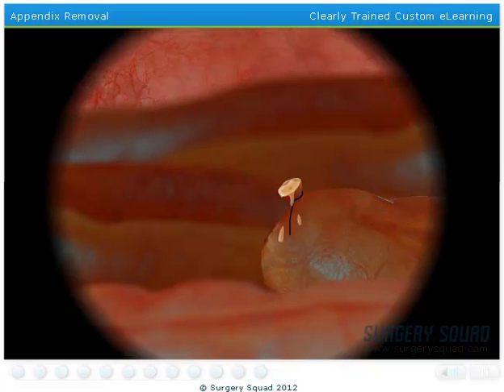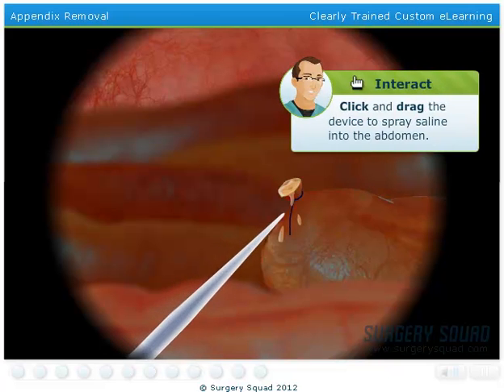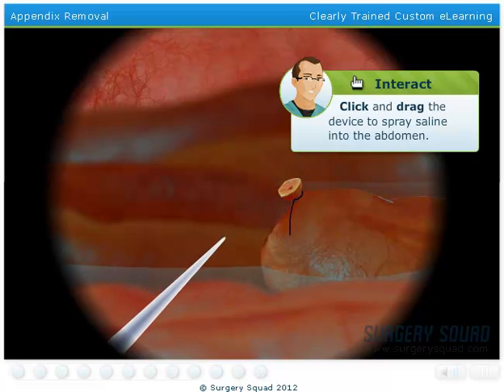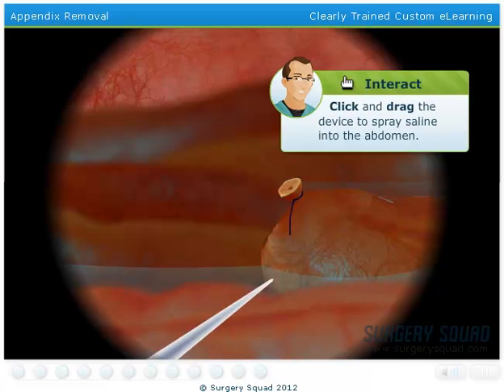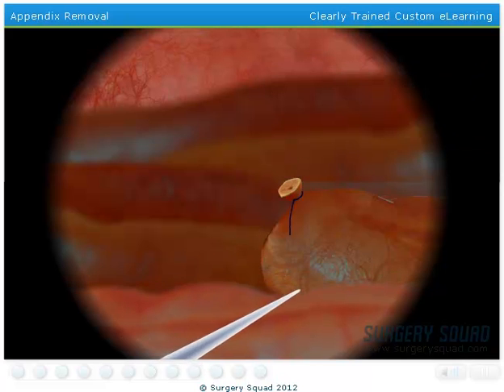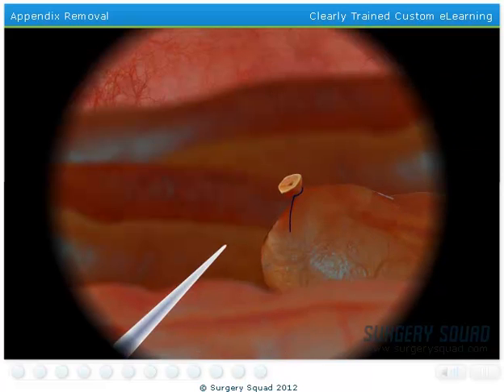Now on to the cleanup. We've inserted a device that sprays saline into the abdomen. Move it around so that everything gets sprayed clean. With a flick of a switch, our saline is suctioned back into the same device.